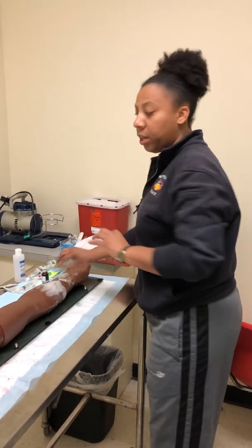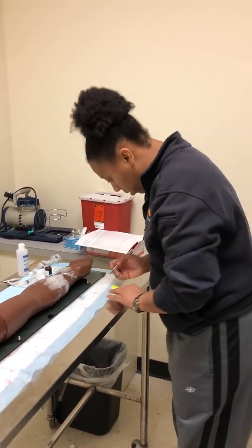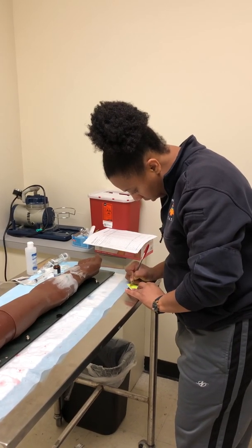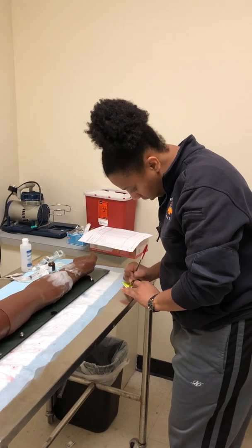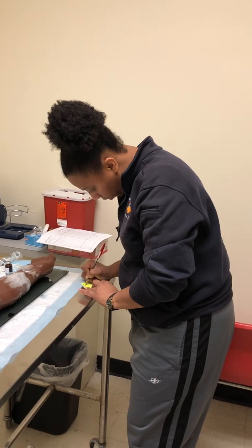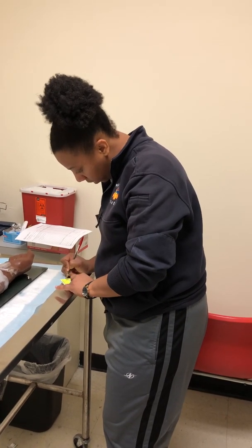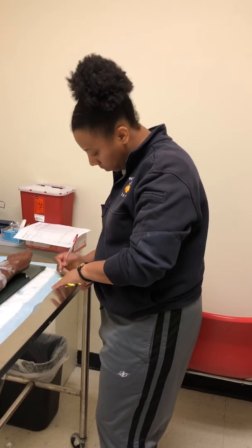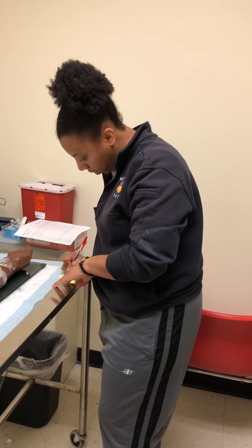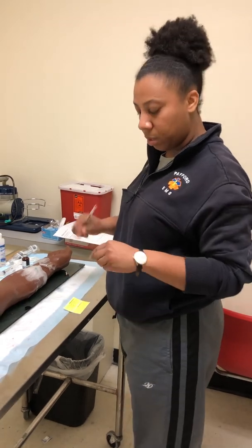All right, I'm going to go ahead and write out my information on my label. So I will put my patient name, which is Janet Green. She is receiving furosemide of 40 milligrams. I will put my date and the time. My name, prepared by, and the expiration date. I will get my equipment together.